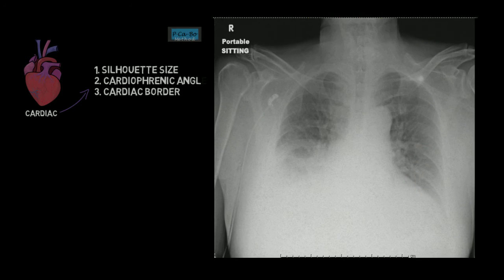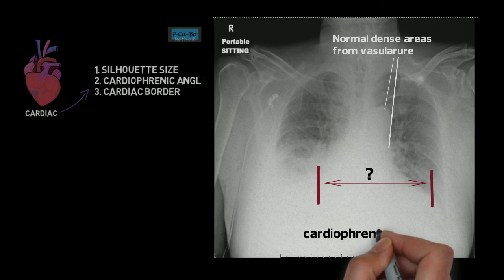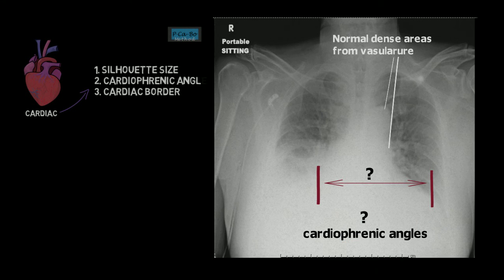Let's look back at this picture. Remember there are three areas to review when looking at the cardiac structures: the silhouette size, the cardiophrenic angles, and the cardiac border or edges. In this picture, the size looks large, although it's hard to tell due to the amount of consolidation. It's obvious the cardiophrenic angles are not visible. As previously mentioned, this patient has pleural effusions, probably pneumonia, and cardiomegaly.